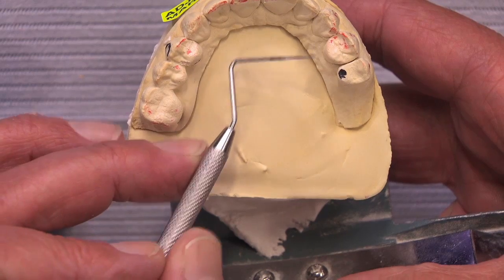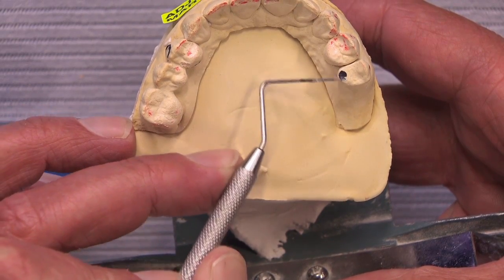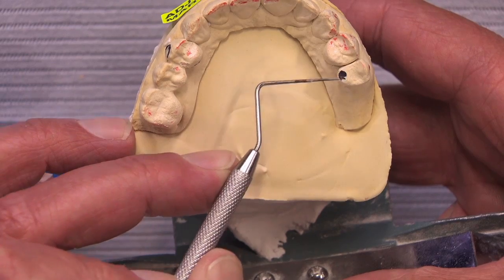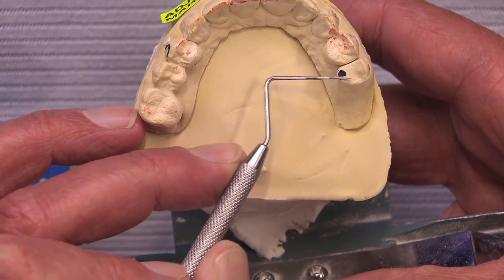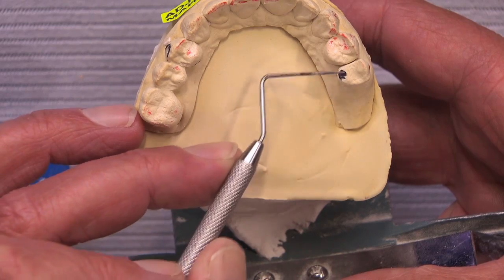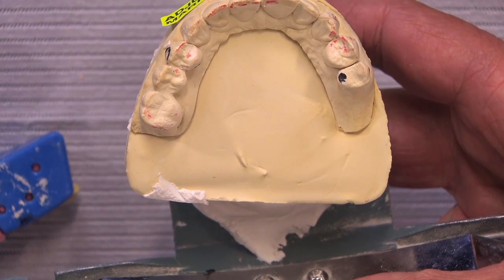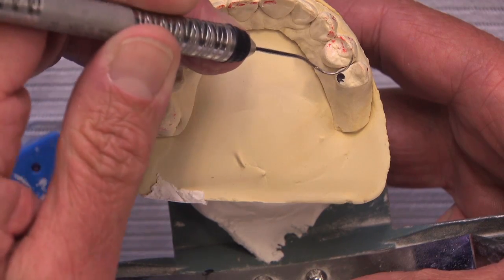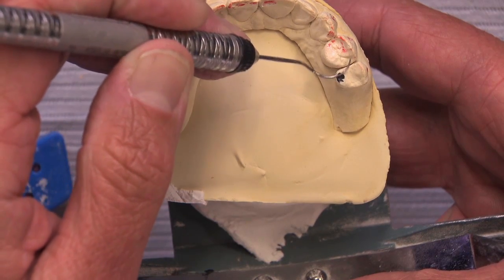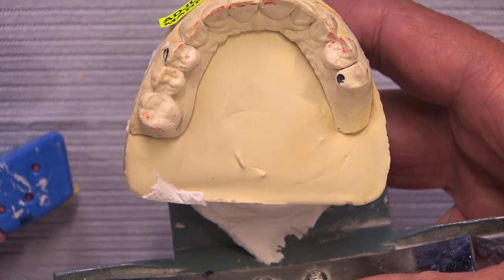And that always sounds better to me than saying, I'm going to take a coarse diamond football burr and at 40,000 RPMs, I'm going to come amputate part of the enamel here because I didn't take it out. So I just say I'm going to recontour that sharp point that the technician found or the computer found there. And again, rather than using a straight taper burr, for me, this is a good reason to use a convex football burr to just go in and get a little bonus reduction as we remove that little spot right in that area.